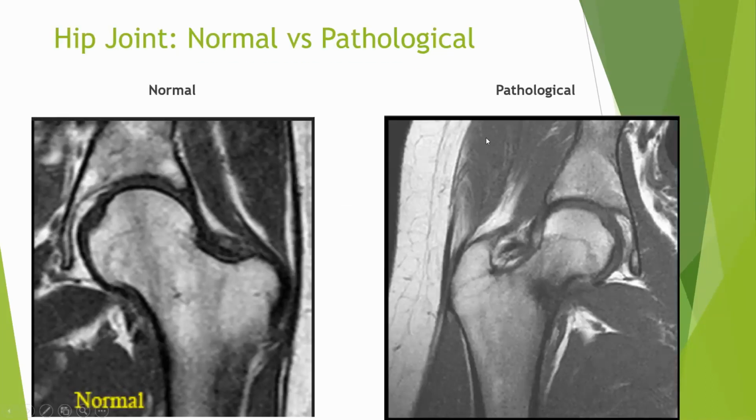I wanted to give you this idea because yes, surgeons do MR scans for bone fractures, but you will not come across them. It is only for surgical technicalities, for them to understand the surgical viewpoint.